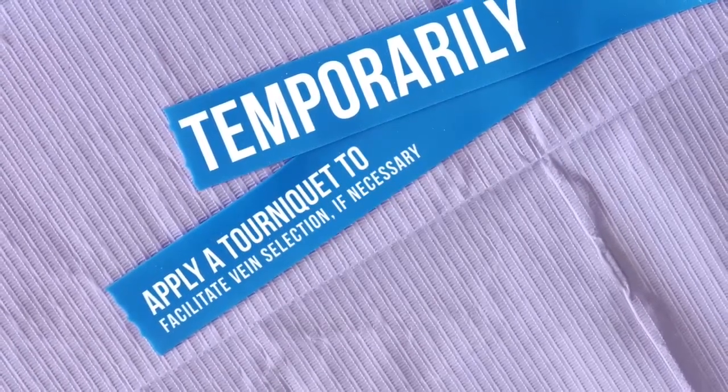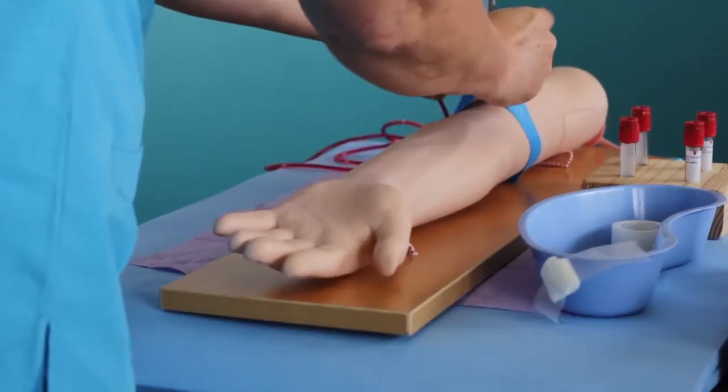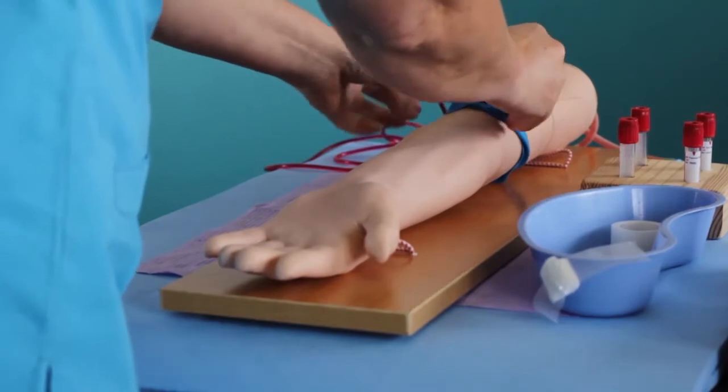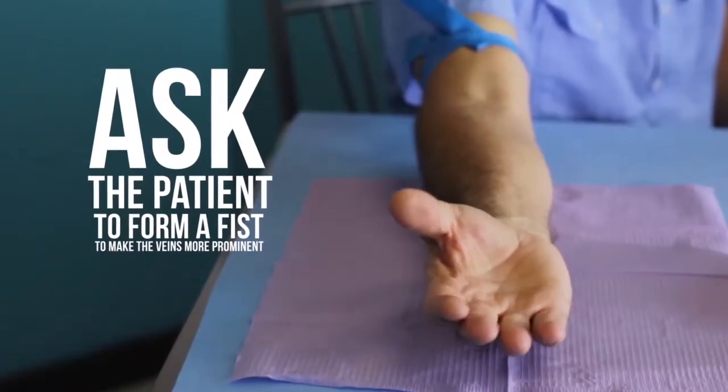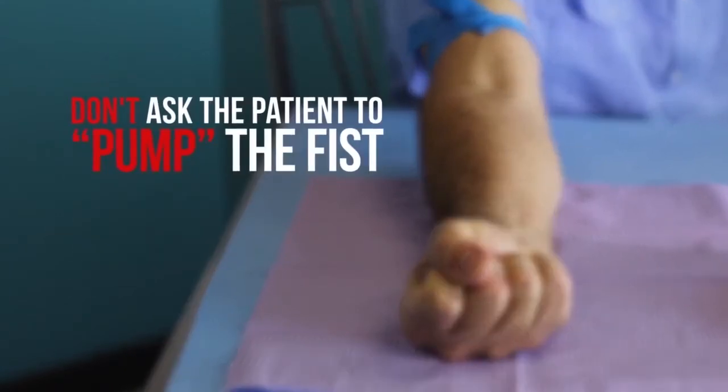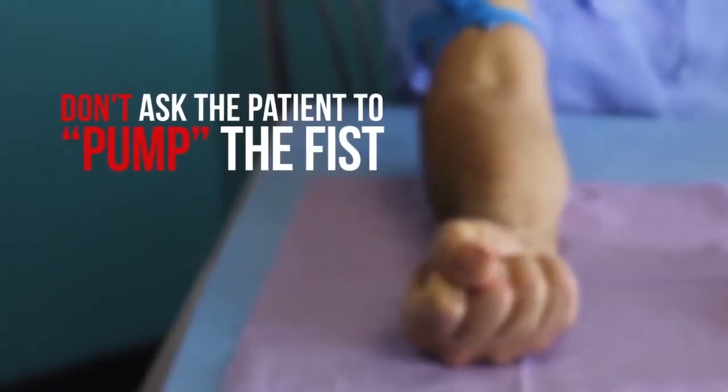When ready to draw the blood, apply the tourniquet about four to five finger widths above the selected venipuncture site. Ask the patient to form a fist to make the veins more prominent. Don't ask the patient to pump the fist.